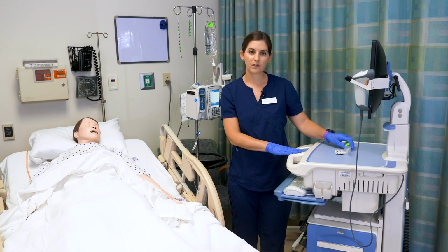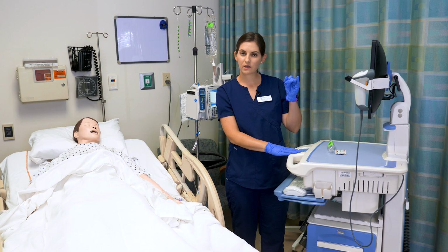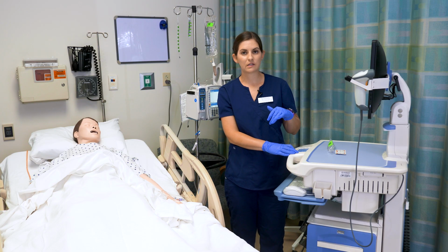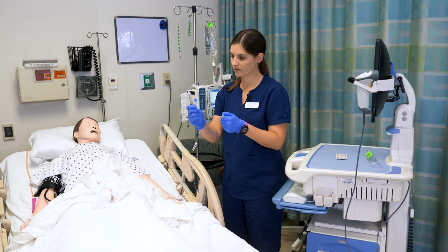Okay, so now we're going to finish that acronym, the SASH acronym. We did our first saline before we administered the medication. We then gave our medication or our fluid. We're now going to finish with a second saline. She has a peripheral IV that does not need the heparin. I'm going to go ahead and get my air bubble out of my saline.